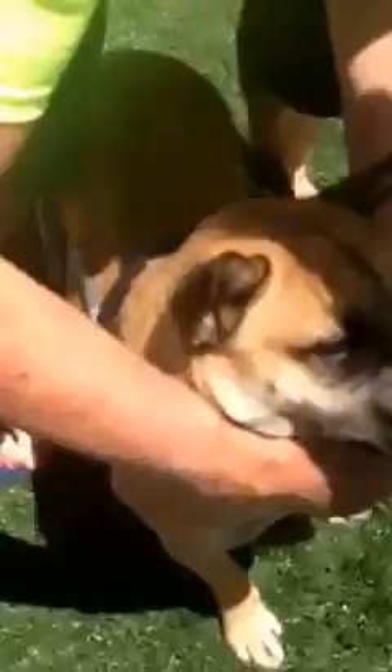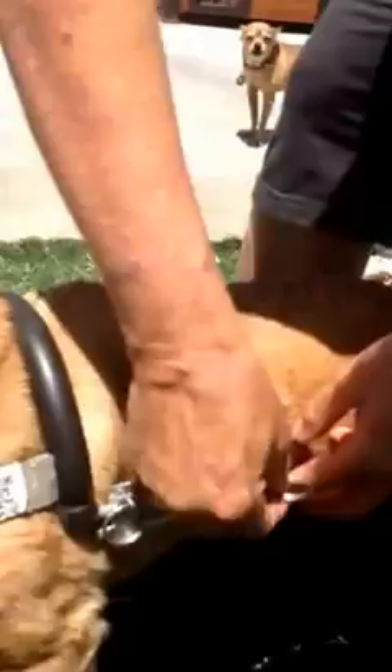Now he will try to move forward right out of it, so we flip this on fairly quickly. You fasten the front first before you fasten the side — do this front first. Then on the side, take the cotter pin, pop him in there, pop it in the second one until it clicks.